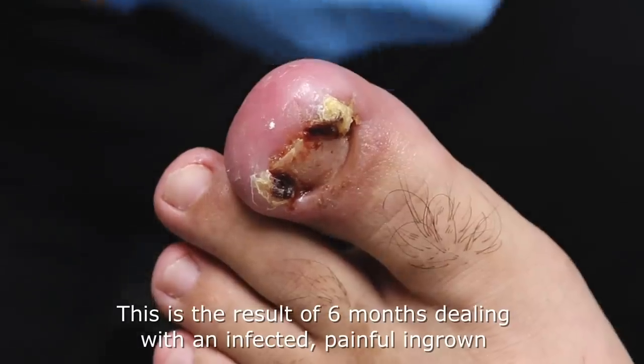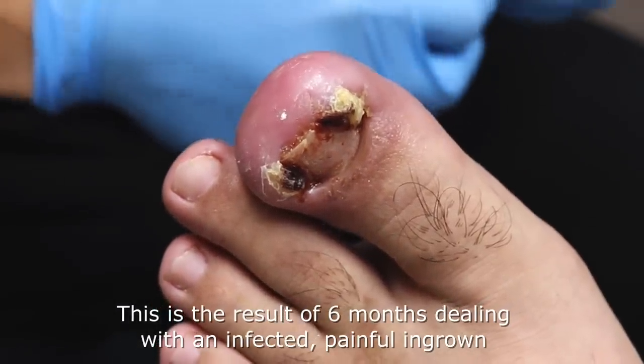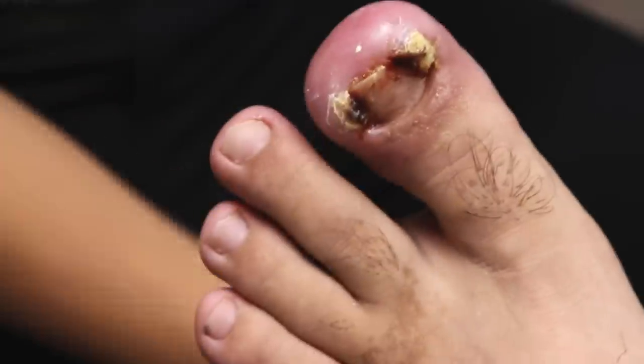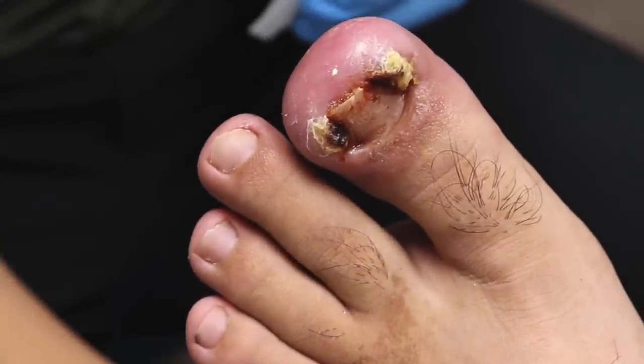When I wear shoes, then it's like pain. It's really bad. But when I wear shoes, then it's fine. Okay, it's the pressure. Yeah, only when something touches it.